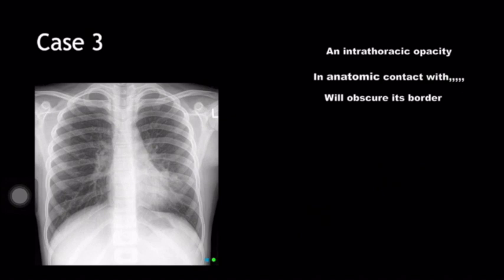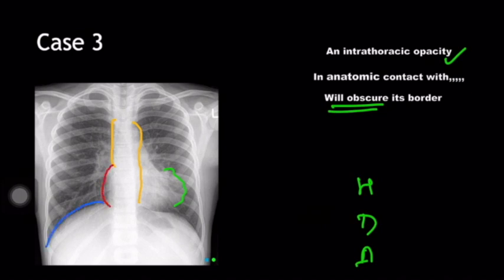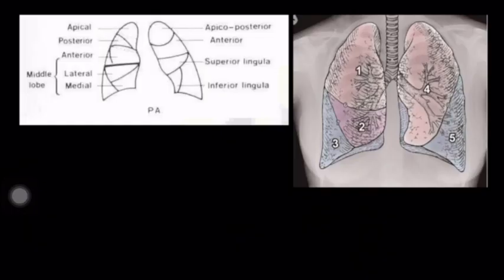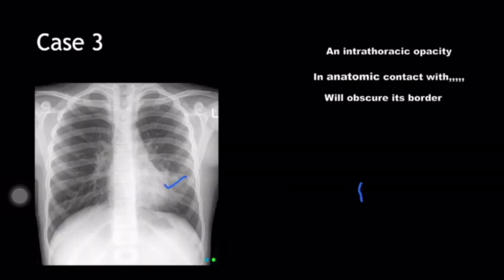Coming to case number 3 — there is an intrathoracic opacity. Let's see what it is obscuring: heart, diaphragm, or aorta? The aortic knuckle is visible, you can see the descending aortic line. The right hemidiaphragm is intact. The left hemidiaphragm is also intact. Now tracing the heart border — you can see it is not clear on the left side, so the lesion is obscuring the left heart border. Going back to the segmental anatomy, the lingular segment of the left lung is in anatomic contact with the left heart border. So we localize this opacity to the lingula.